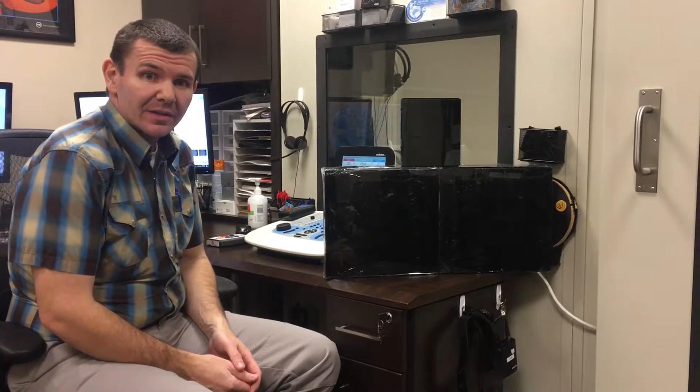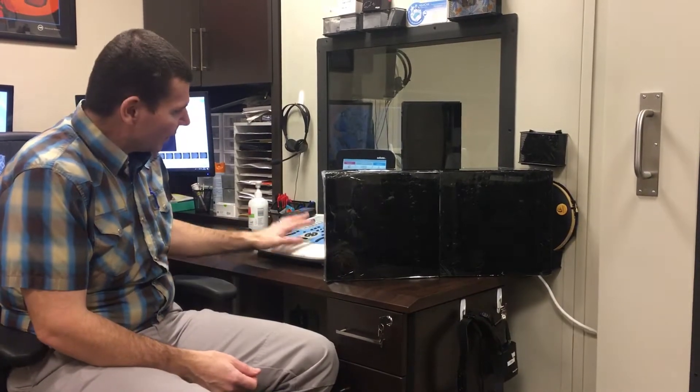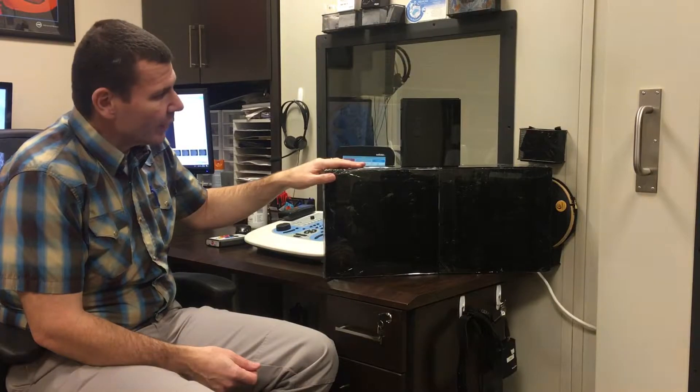Hi, this is Joe Danzi with Condition Play Innovations. Today we're going to show you a video about how to use the hardwired option from your AudioStar Pro to the VRA Pro 1.0.